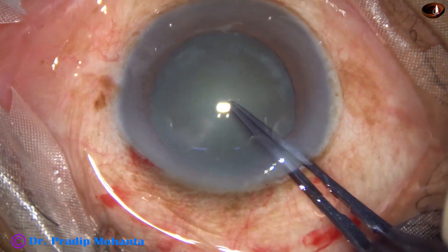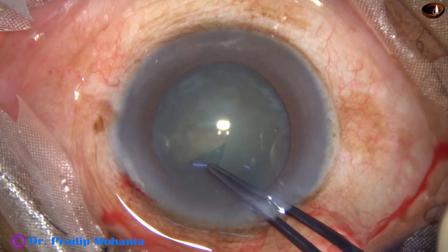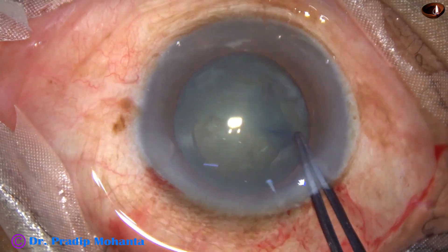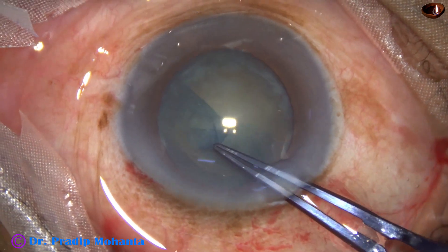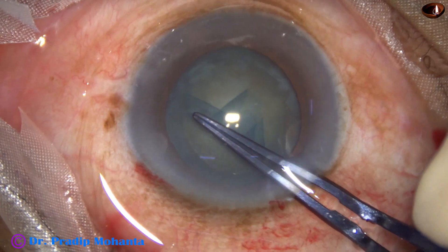Capsulorhexis is done with the help of Utrata forceps. If the zonules are strong, we can easily make a puncture at the center of the anterior capsule, raise a capsular tag, and perform a nice continuous curvilinear capsulorhexis (CCC).